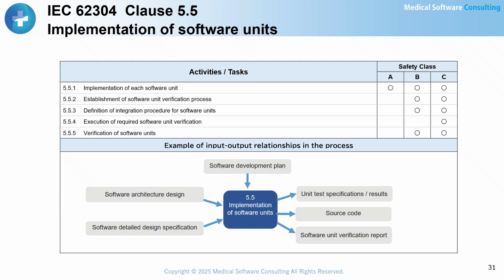To ensure the quality of the source code, it is important to establish coding rules and apply a consistent coding style. In addition, static analysis tools should be used to check code quality during development, making sure that all warnings are eliminated as the code is written.